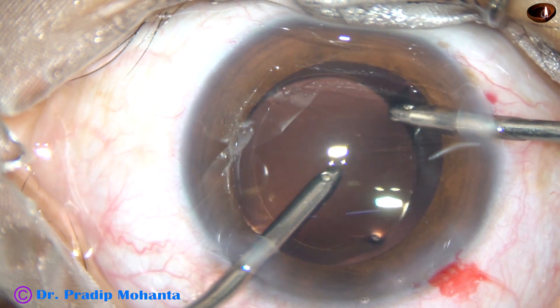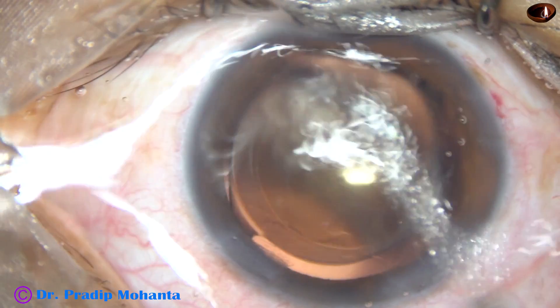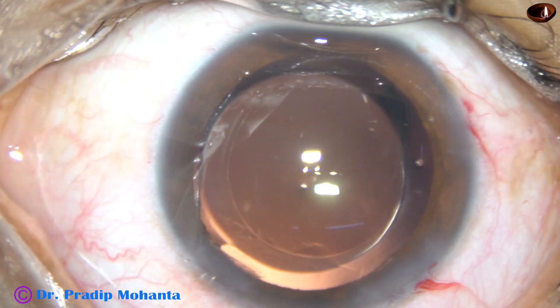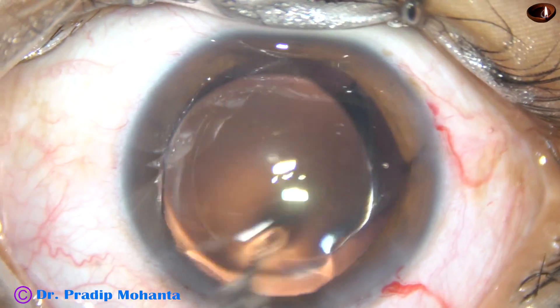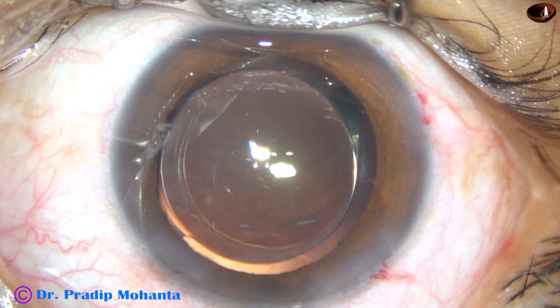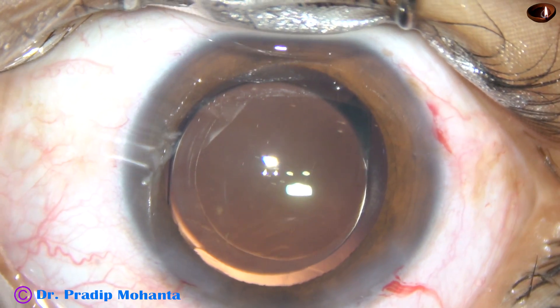If you clean the viscoelastic substance in this way, most of the time you will get a very clear anterior chamber next day. There will be no rise of intraocular pressure, the cornea will be clear, and the patient will be very happy.